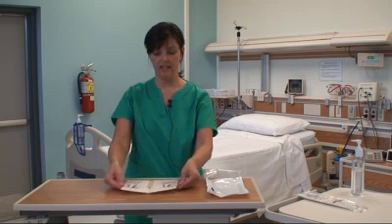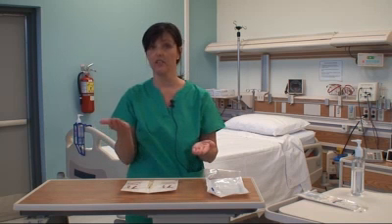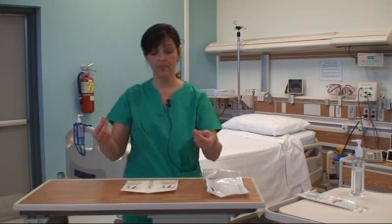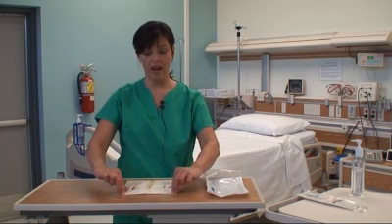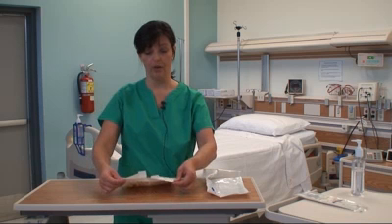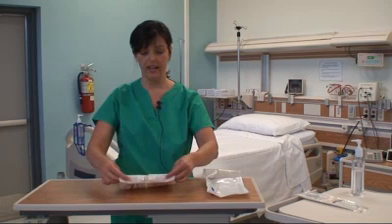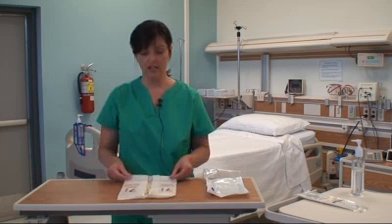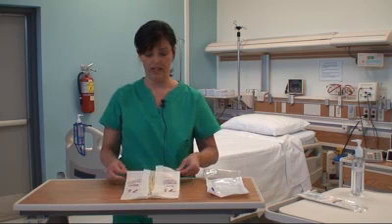I'm positioning it so that the left glove is on the left-hand side and the right glove is on the right-hand side. Then I'm going to open up the packaging, remembering that you have a 1-inch border where your hands can touch. It's a good idea to pull the packaging taut so that it doesn't bend back over when it's been opened.